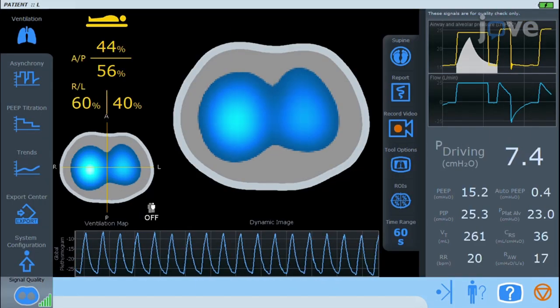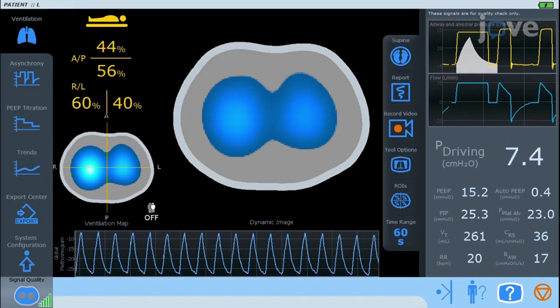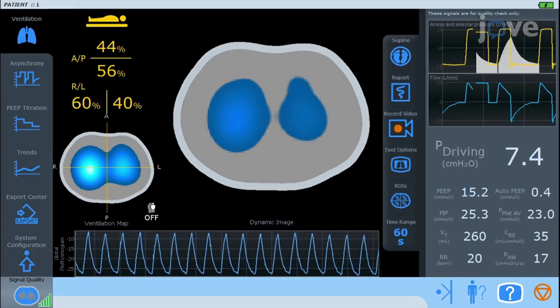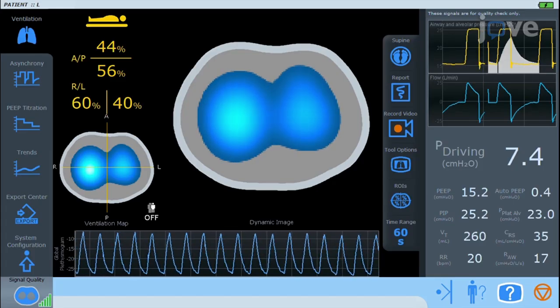Start monitoring in the absence of patient movements. The EIT will generate two images: the dynamic image and the ventilation map.